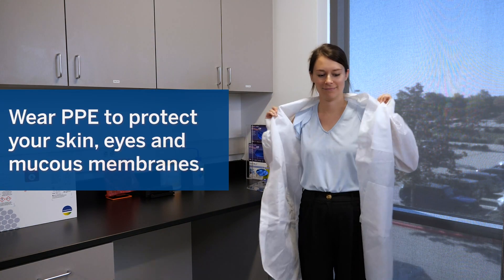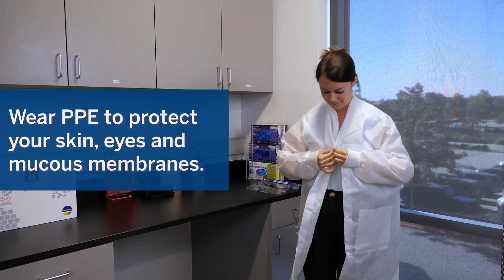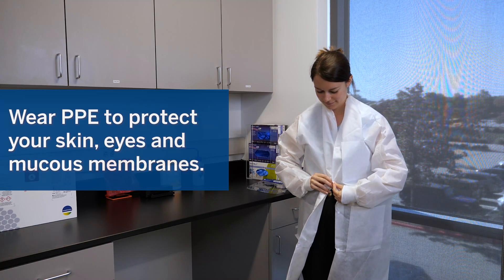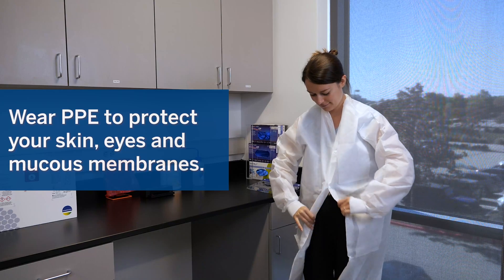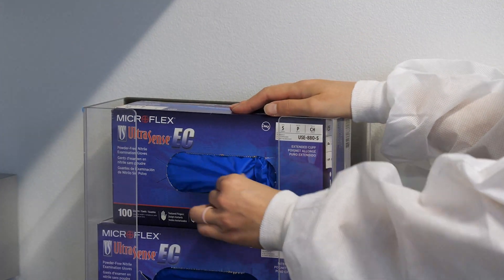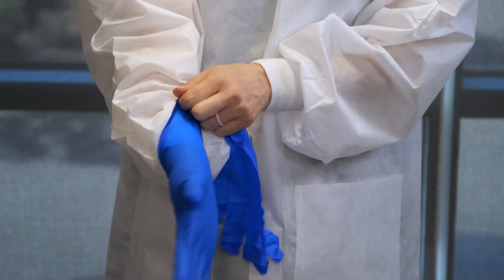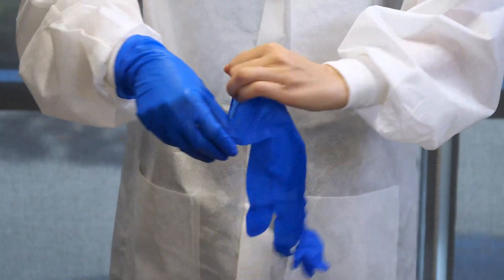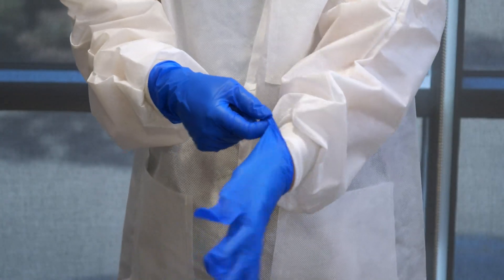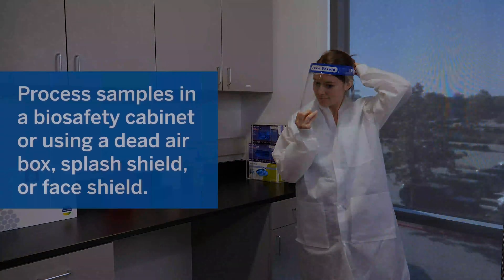Always wear appropriate Personal Protective Equipment or PPE, including but not limited to disposable clean powder-free gloves and a lab coat. Be sure to protect your skin, eyes, and mucous membranes. Samples should be processed in a clean biosafety cabinet if available or according to local laboratory guidelines.